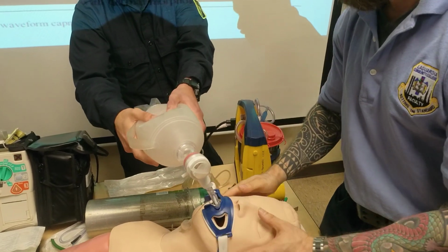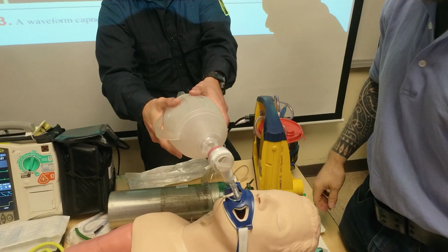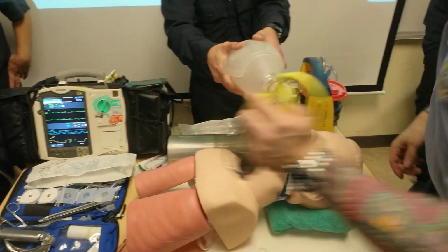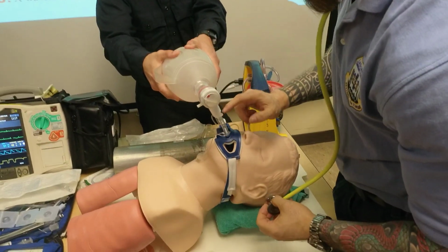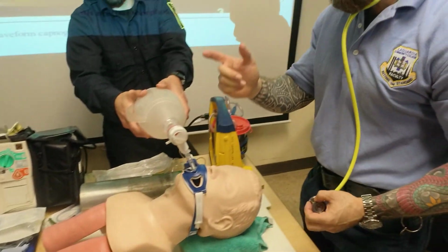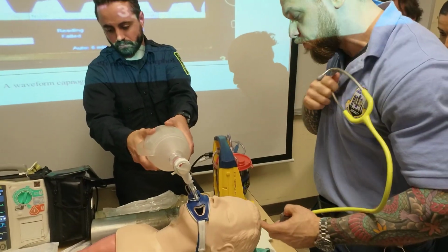Once I secure it, what do I need to do? Lung sounds. Reconfirm everything. So what do I reconfirm? Tube depth. What else? Lung sounds. Right. What else? Pulse ox. Everything. So from the start, the moment I resecure, 35, 45, 99%. Squeeze, squeeze. Anytime you move the patient, reconfirm. Anytime you do anything, you reconfirm. Right. So this is the procedure for the intubation.